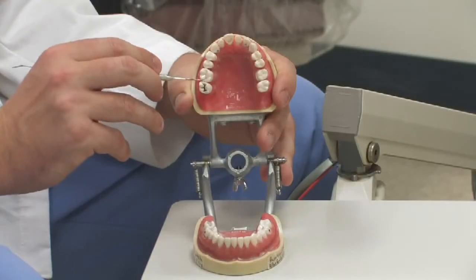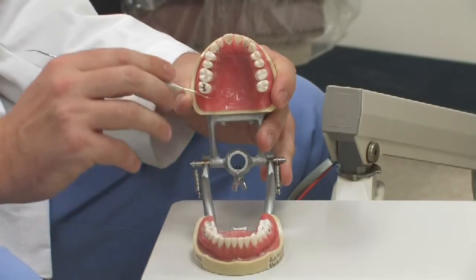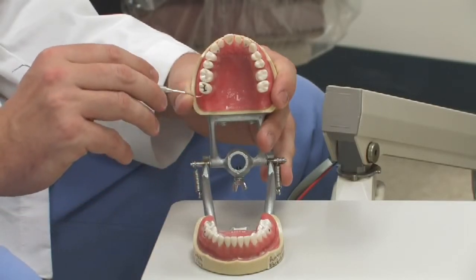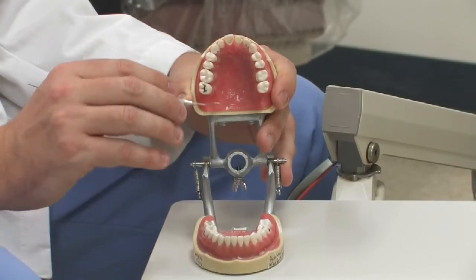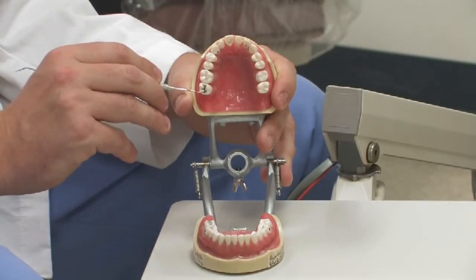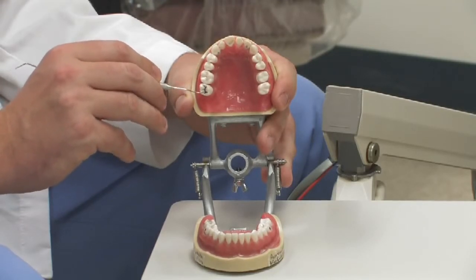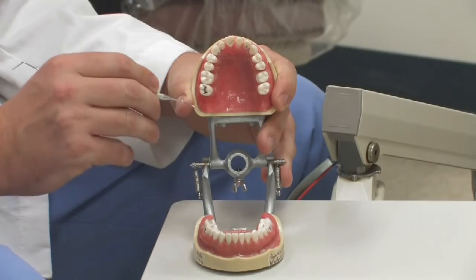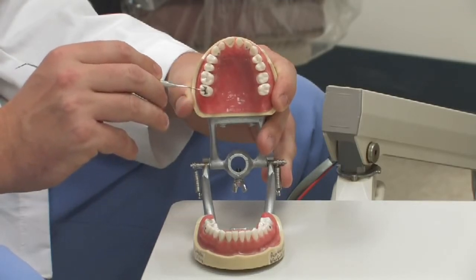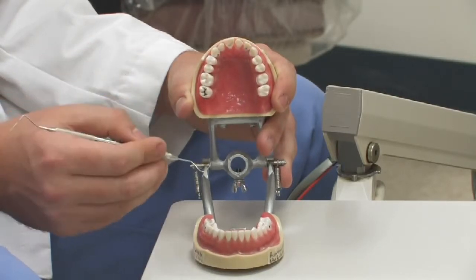In this model, we have a designation of what a typical cavity would look like. When you're going around the mouth looking for cavities, we're looking for dark, heavy stains or anything that looks a little unusual. So here on this tooth, we have this dark light highlighting an example of what a cavity looks like. This is on the second tooth from the very back on the upper right, and what you're seeing is some very heavy stain with a little bit of cavity. Once we've identified that that's a cavity, that's when we decide that we're going to do a filling.